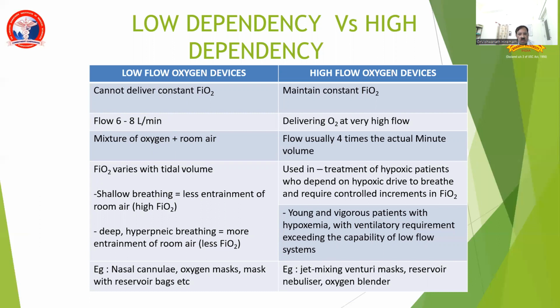A higher flow rate is required. For achieving low flow, a mixture of oxygen and room air entrainment can be used. For high flow devices, a flow of usually 4 times the actual minute ventilation is required.